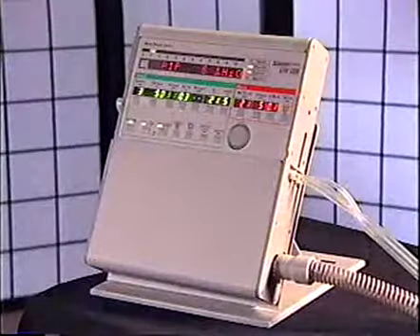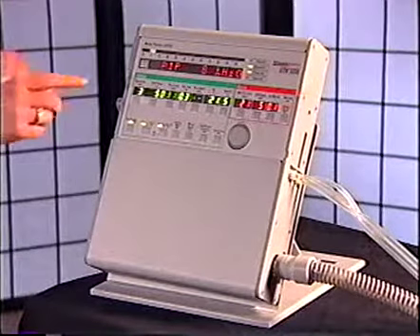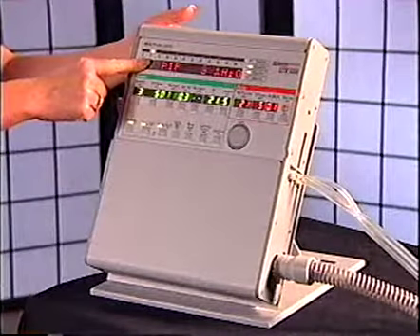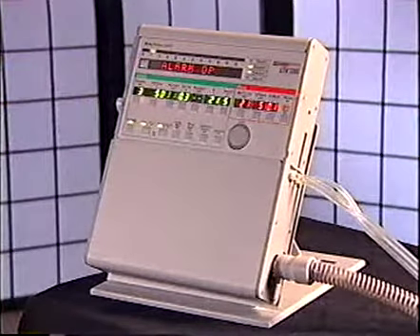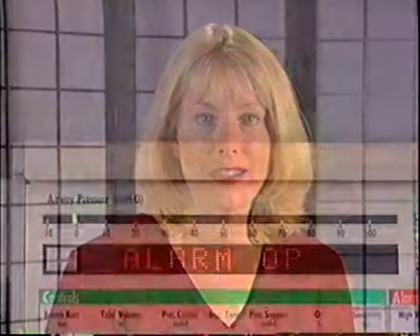position. In order to access the Extended Features menu, simply hold the Monitor Select button for 3 seconds. The LTV uses these extended menus to keep the front panel simple and uncluttered. Note that you cannot enter the Extended Features menu when the controls are locked.